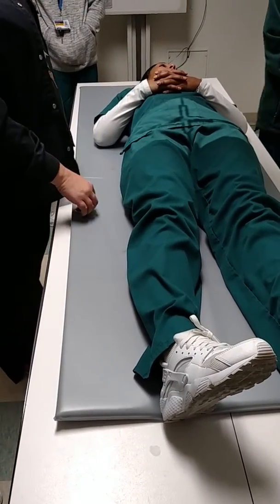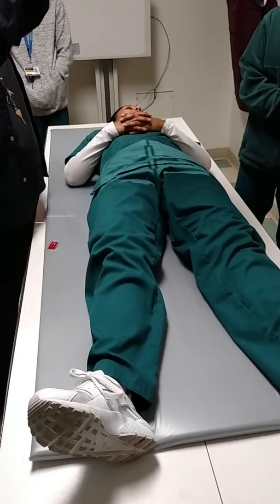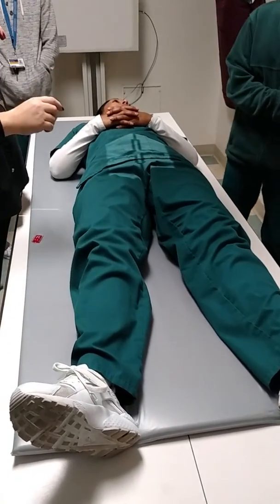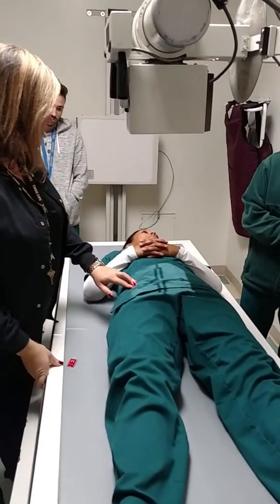AP hip. Okay, relax. All right, so our hips are going to be unilateral. You might have them bilateral out there, but we're just going to do unilateral. 10 by 12. All right, central ray is mid-femoral neck.